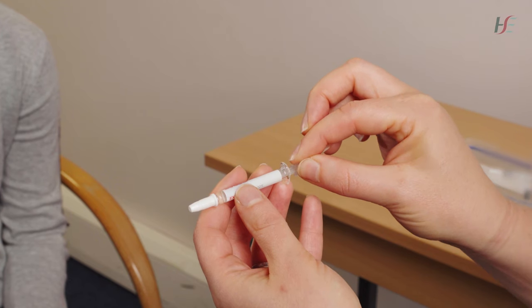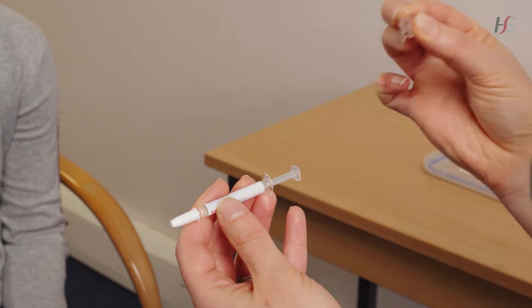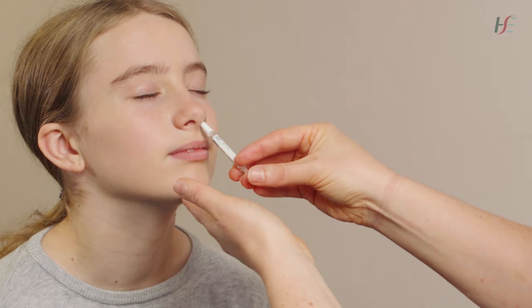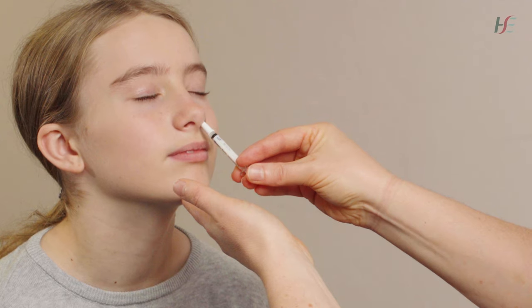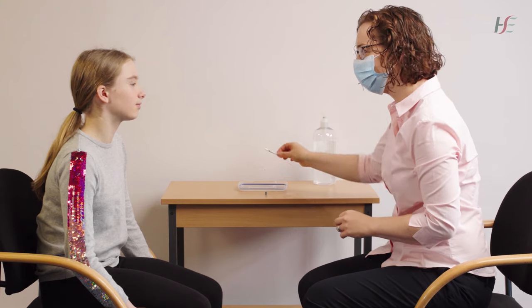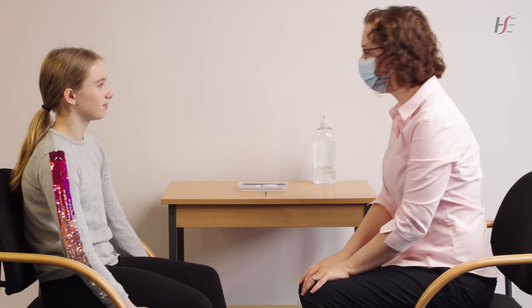Next, pinch the dose divider clip and remove this from the applicator. Place the tip of the applicator just inside the left nostril and push as quickly as possible to deliver the remaining 0.1 mL of vaccine into the child's nostril.